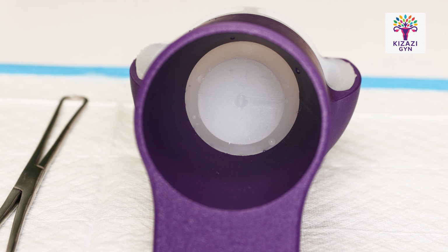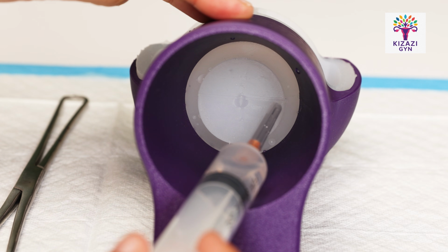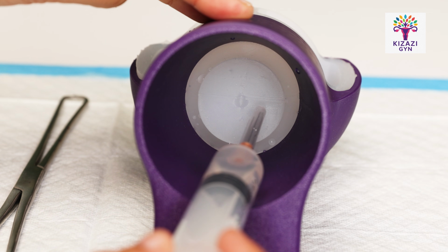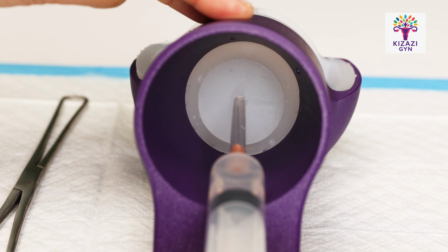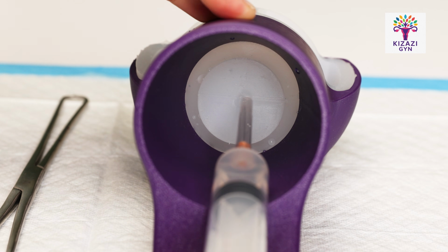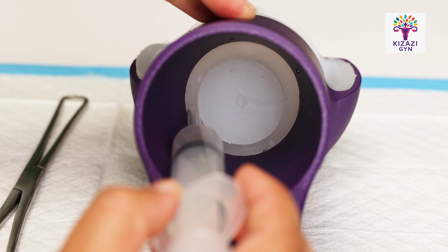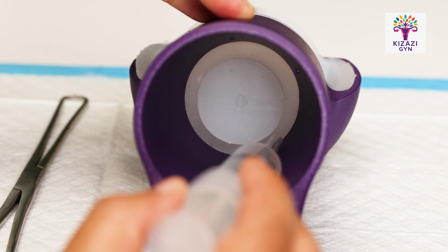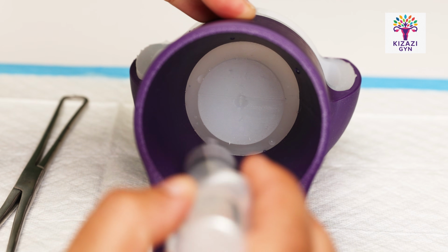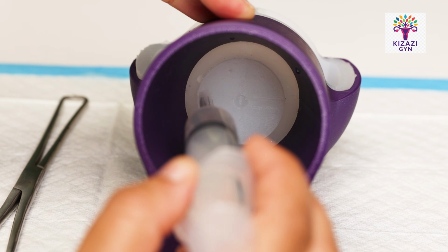Let's talk about cervical anatomy. What we have here is the beginner, more anatomically obvious model. You have the cervix here and the cervical os right here in the middle. When you're doing your paracervical blocks, you are going to inject lateral to the actual cervix in these vaginal fornices, lateral vaginal fornices. You can think about it like a clock, starting at 12 o'clock, 6 o'clock, 3 o'clock, 9 o'clock.